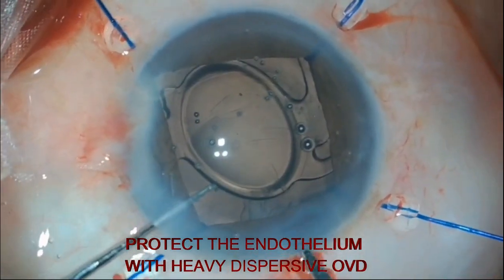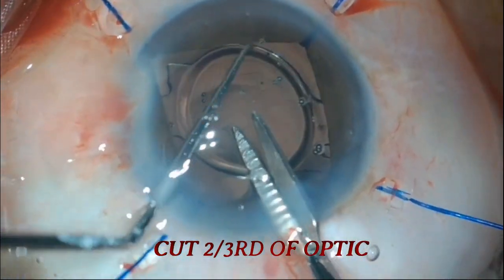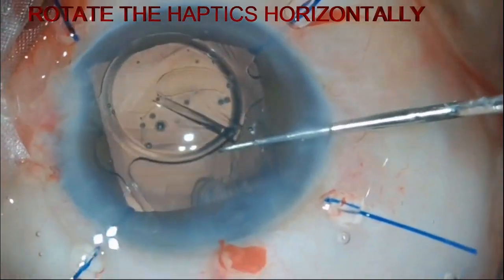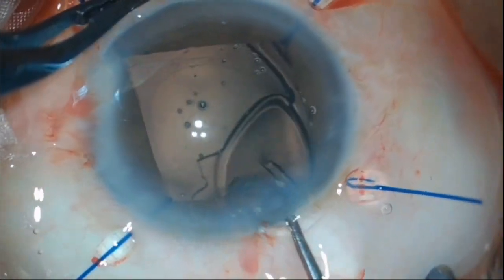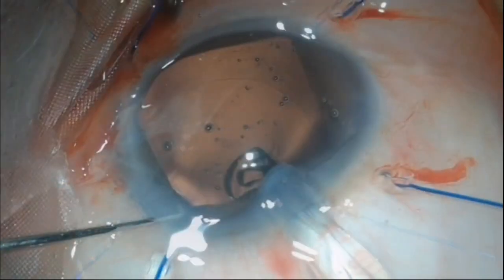Damaged IOL can be removed by 2 ways. First is by cutting the optic till the 2/3 part and placing the haptics horizontally. Then hold the optic part and pull it out through the main port, then twisting it to remove the other part of the optic.